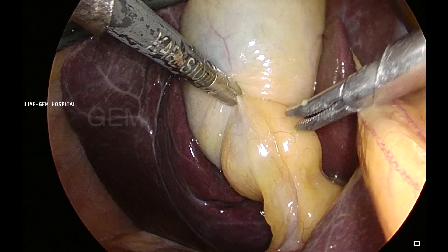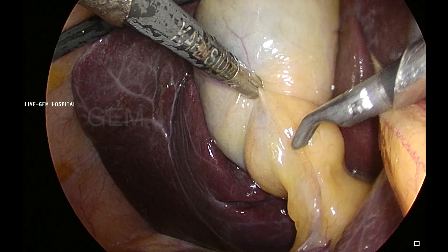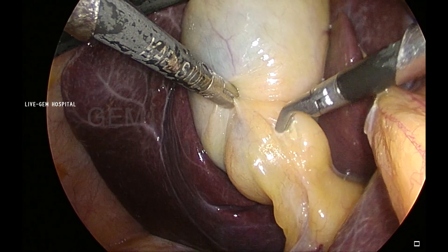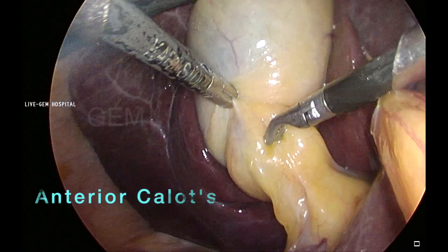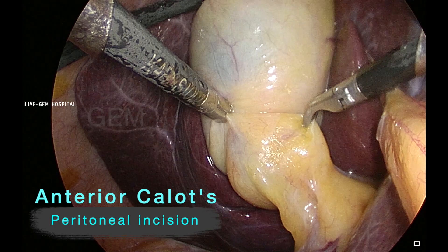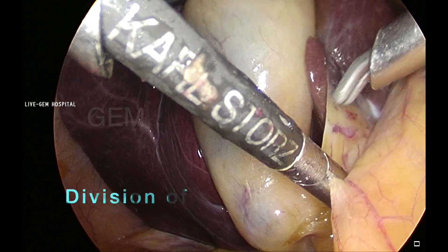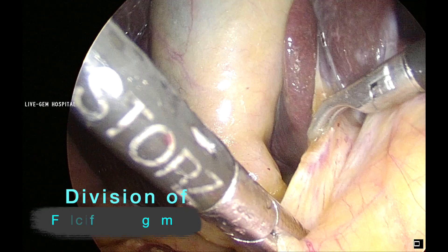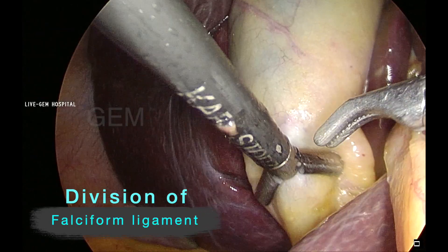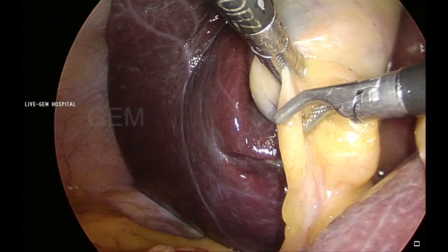You can appreciate that the left lobe of the liver is coming forward and the falciform is also a little bit attached on the quadrate lobe. The first step will be to hold the infundibulum and then make a peritoneal incision anteriorly and then posteriorly in a U-shape manner. I do not dissect any structure — I only make the peritoneal incision. So I am dividing the falciform attachment on the quadrate lobe a little bit.